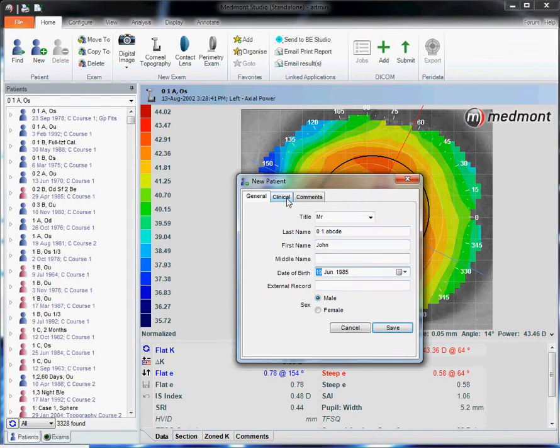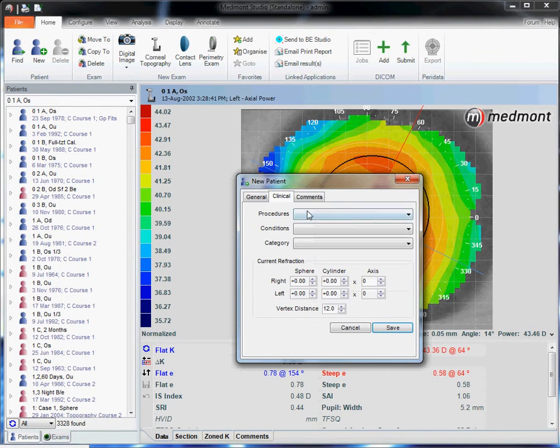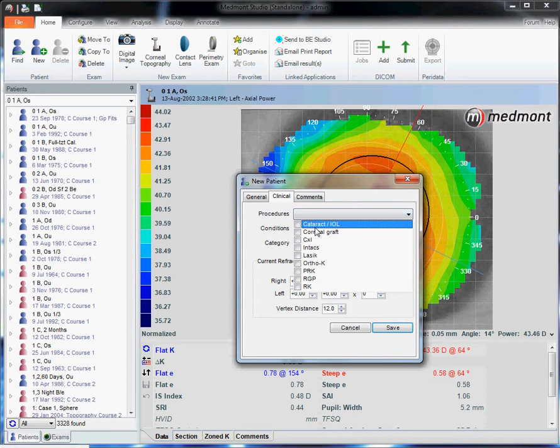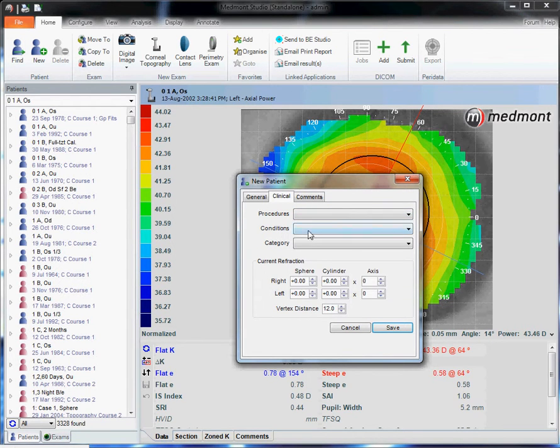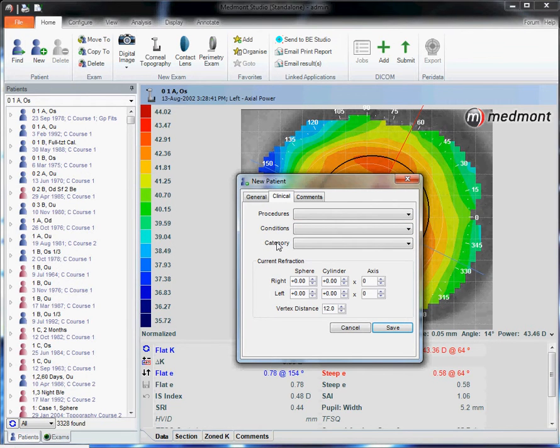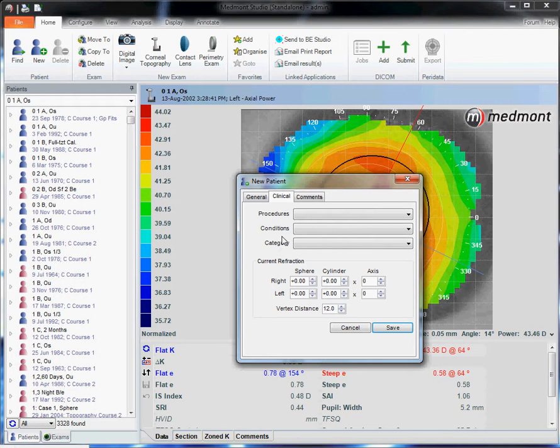You can go to the clinical tab and select any procedures or conditions this patient may have had. That way you can filter at a future point all the patients with, as an example, keratoconus or all the patients who have had orthokeratology or all the patients who have had corneal transplant.